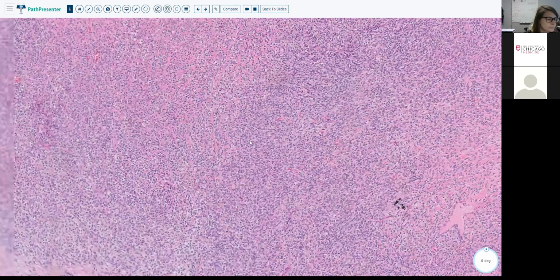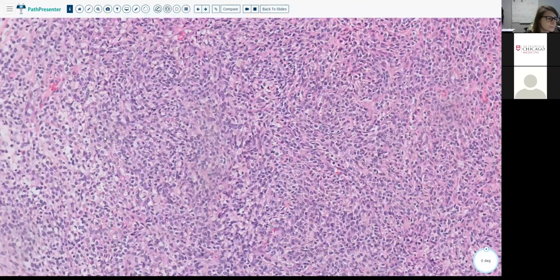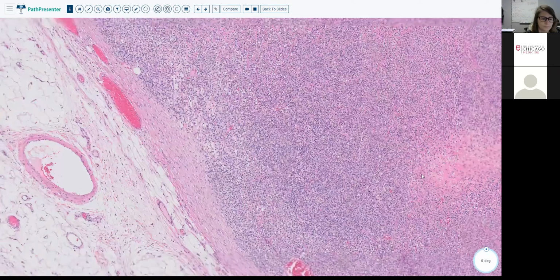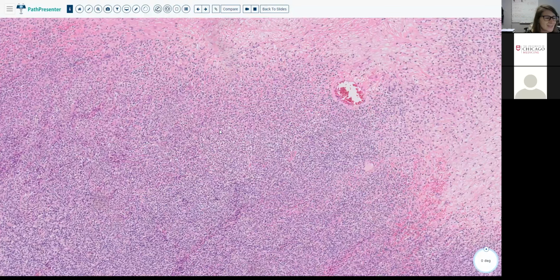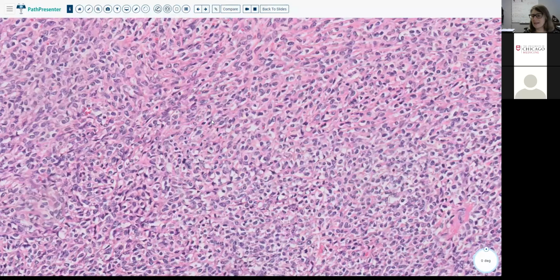And synovial sarcoma, what would you stain it for? First of all, a lot of them can be keratin positive. I'm trying to remember, there's a more specific stain that relates to the translocation, doesn't it? You meant TLE1. EMA and TLE1, exactly.